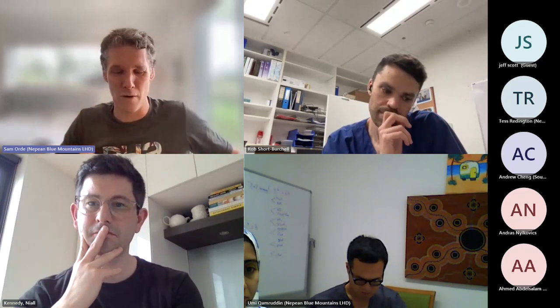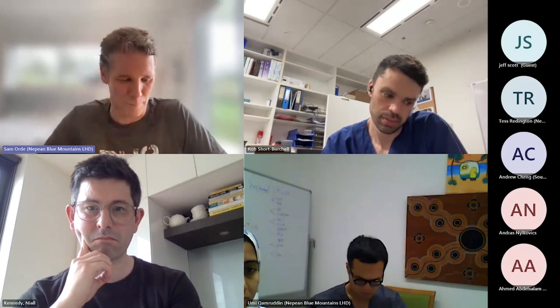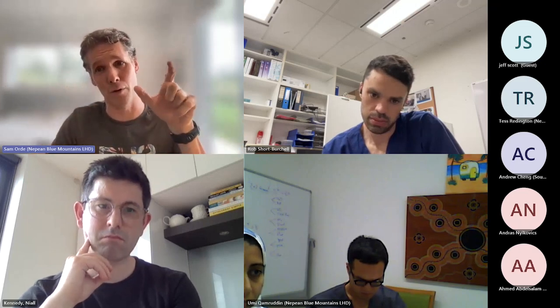Yeah. I think the thing that I'm doing more and more in my clinical practice as I start to use it in those patients that I described is the importance of repeating the analysis. So I do a quick point and shoot where you're just looking at the change in the E to A ratio after a fluid bolus.